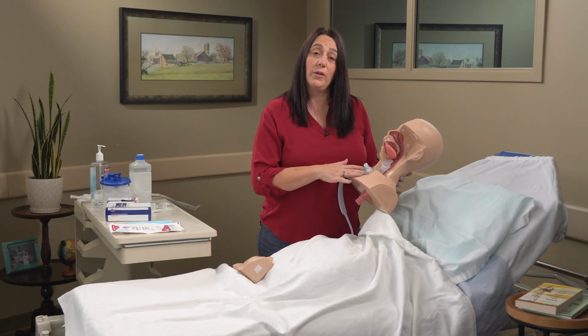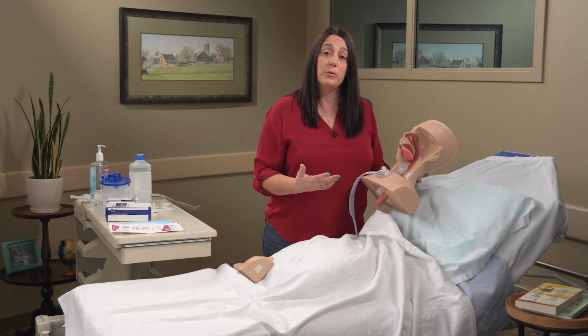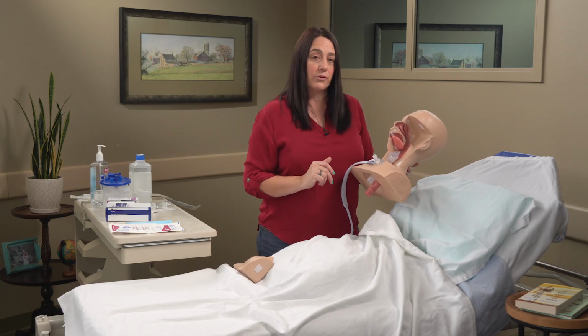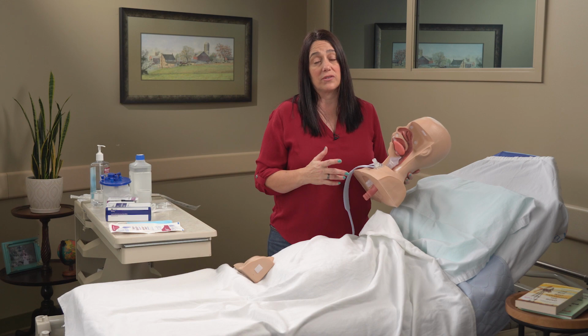So if the person looks like they're anxious, if they're looking at you like they need help, they're trying to cough and it's not working, get help. And then come and encourage that person to cough while you're waiting for the help to arrive. The other thing to know about the tracheostomy is that if you're moving that tube around, that can be uncomfortable for that person. So you always want to be careful when you're helping them with daily cares to make sure that you're not bumping that unnecessarily and causing that person discomfort. It's normal for that person, whenever the nurse is doing cares on that site, to cough because it is going to irritate that person's site.